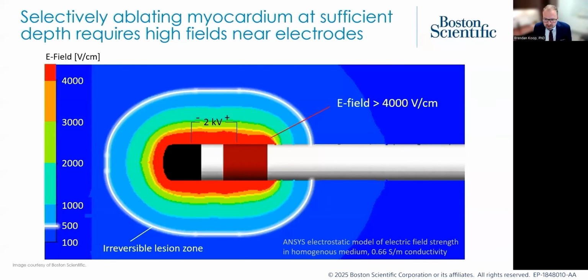So that is very high field, and it's one of the reasons that we do see some transient effects in other tissues. And it's one of the things that we keep a close eye on as designers. So the way we can help make the situation better is to change the spacing of electrodes, change the surface area of the electrodes. These are the things that we try to design for to minimize these effects.